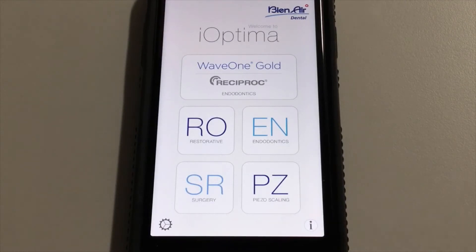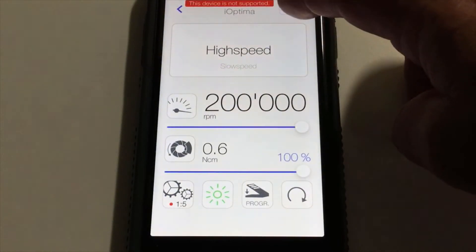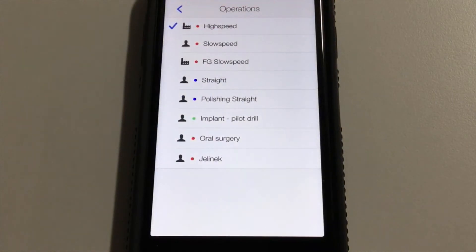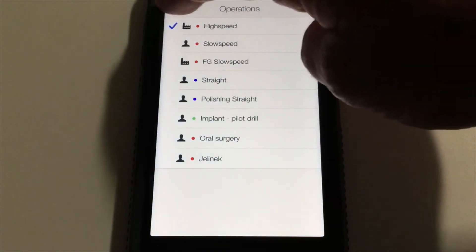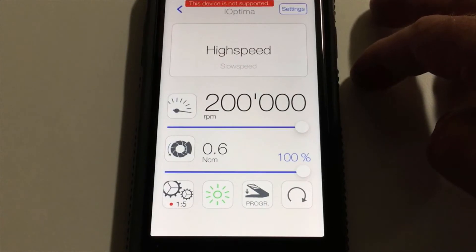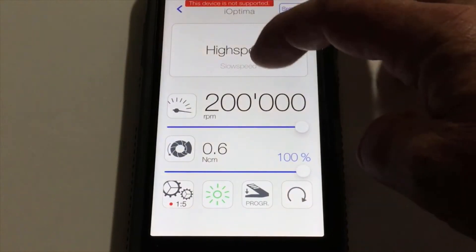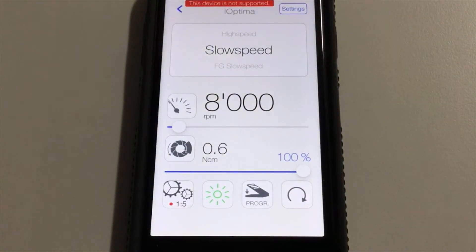The first would be restorative mode. From here, if I hit the settings button, you'll be able to set up and program any clinical function that you would want in the system and have that preset for your use. To toggle between different programs — as mine is currently set for a high speed function — I would then be able to just swipe up on the screen and automatically go to a low speed function.